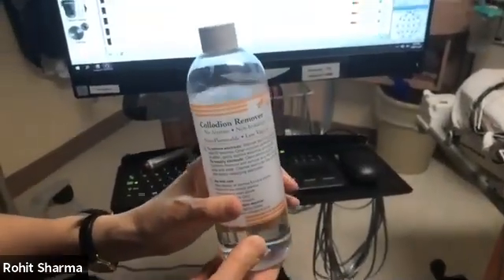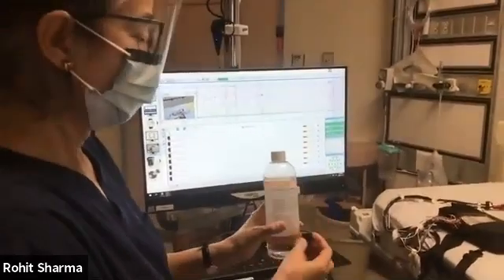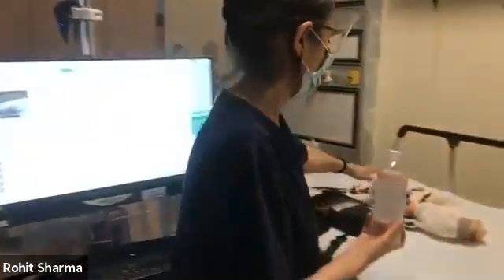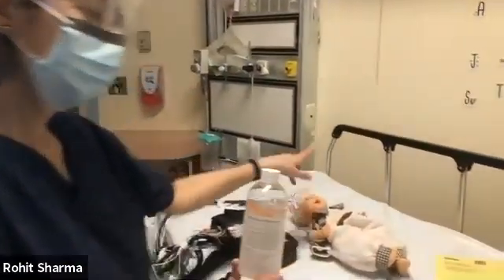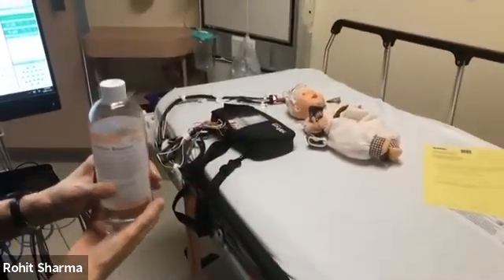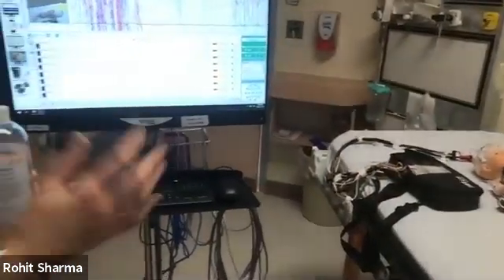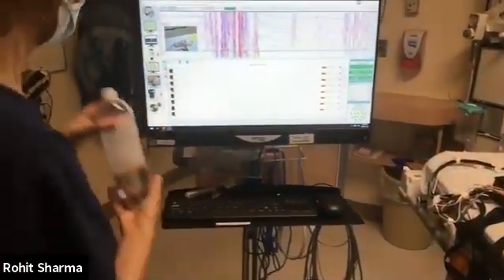So we highly suggest that you put some in the kidney basin, and then you just take some of it and soak the EEG electrodes on the patient's head with it, and the electrodes will actually just come right off. You don't have to worry about it. And then you can just put the bag back. They're actually disposable. Please feel free to throw them away.